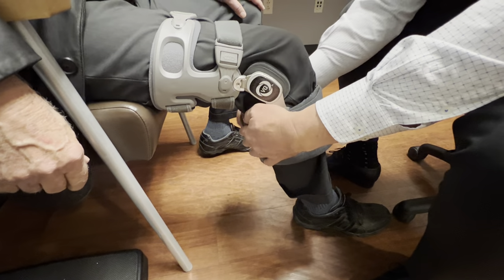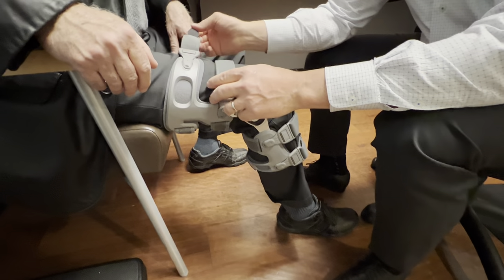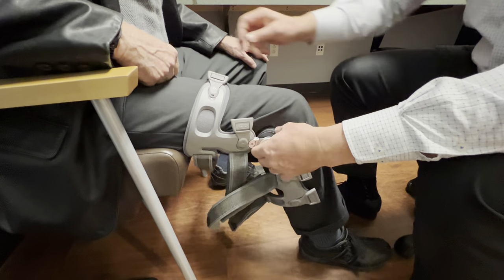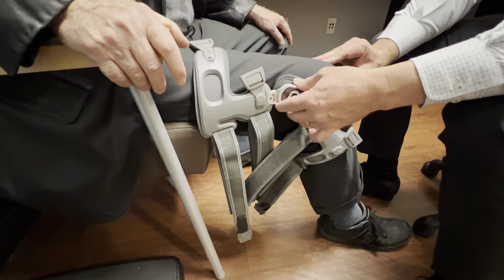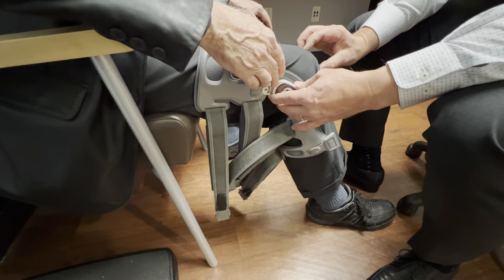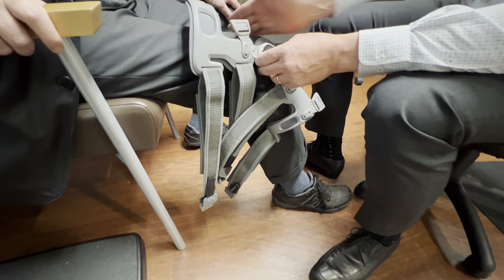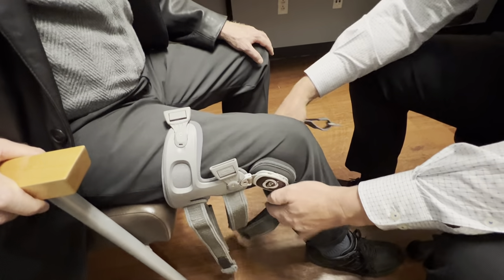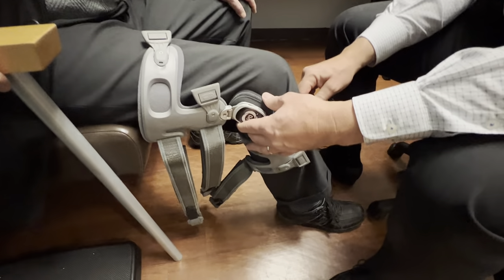Let's talk about a couple of common errors. It's kind of hard to put the brace on too high, but I see a lot of people come in with it way too low. You want it right across from the kneecap and right on the side of the knee — not here in front. That's a funny angle on the joint that's not going to offload your knee. Two things for the brace to be effective: one, you've got to wear it; and two, you've got to put it on right.